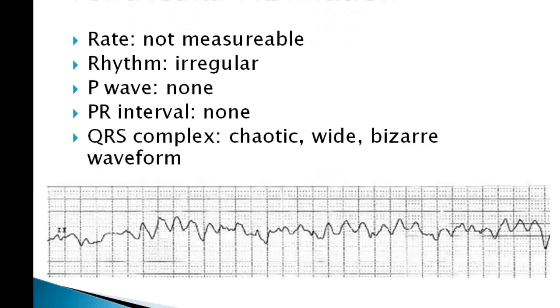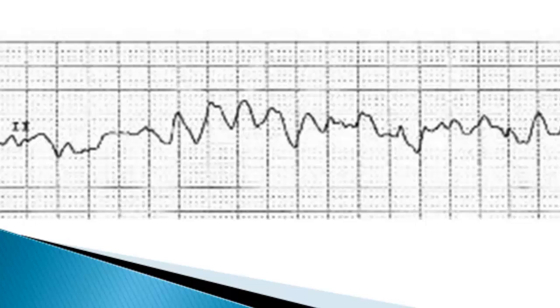Notice the difference between the ventricular fibrillation and the ventricular tachycardia. The tachycardia, at least the bizarre waves looked similar. That does not happen with ventricular fibrillation.